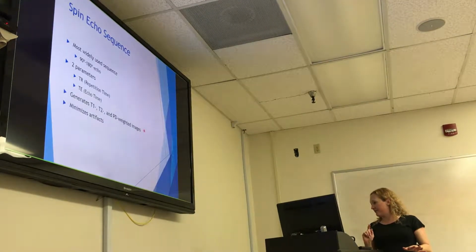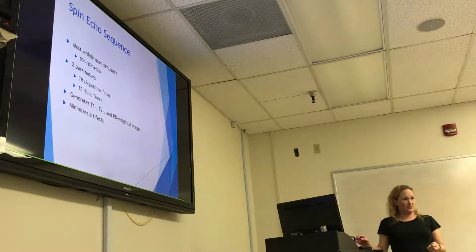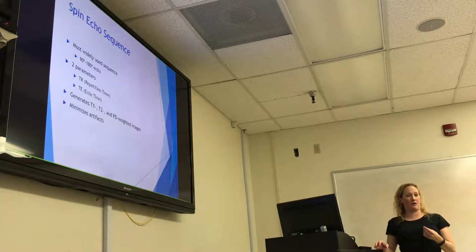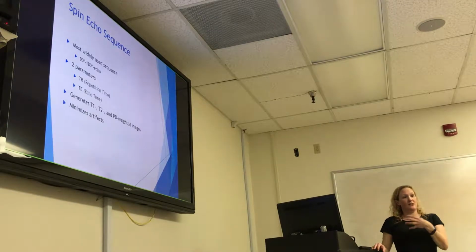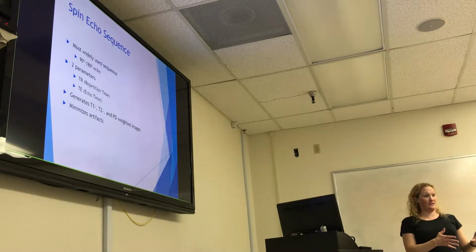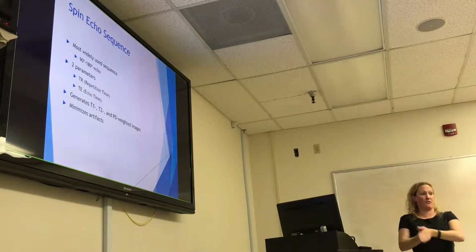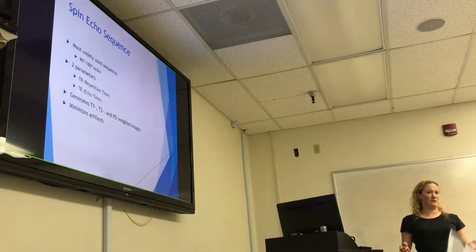Another question from the homework. Is the spin echo more desirable because it's maximum signal induced in the coil? Yes, it does have better signal than a gradient echo, and so they are desirable for that reason, but there are, as there always are, drawbacks, okay? And so there are reasons why you would run a gradient echo versus a spin echo, one of those being time, okay?